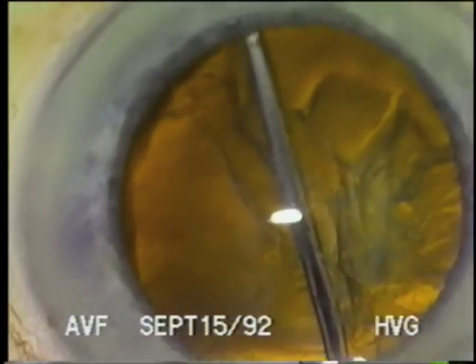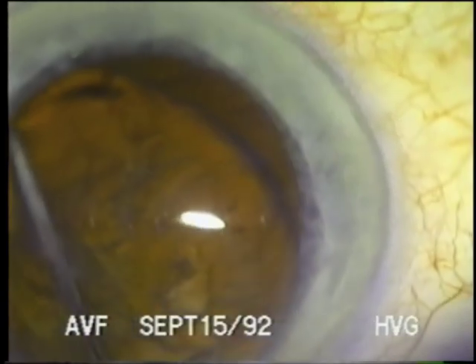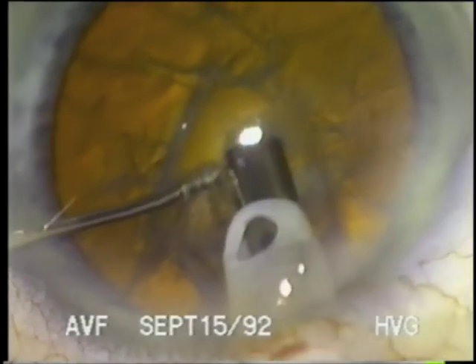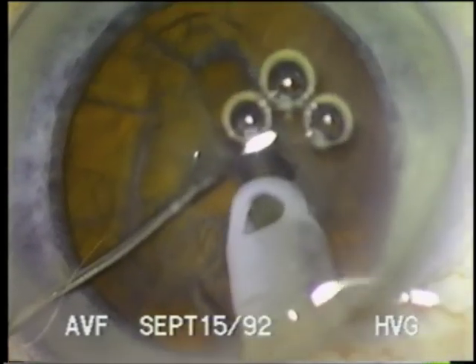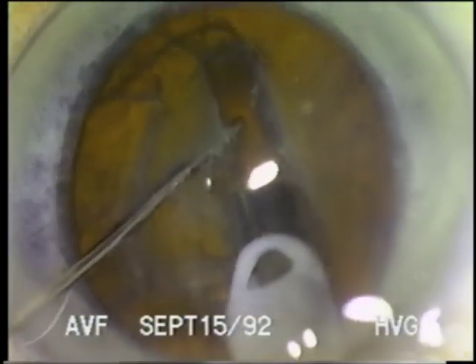Rotation of the lens after hydrodissection ensures that it is completely separated from the capsule, facilitating rotation for subsequent fracturing. Note that the nucleus is stabilized with a second instrument, which also helps to stabilize the eye. A long sculpting pass is made with a phaco tip, and then the second instrument nudges the nucleus inferiorly.